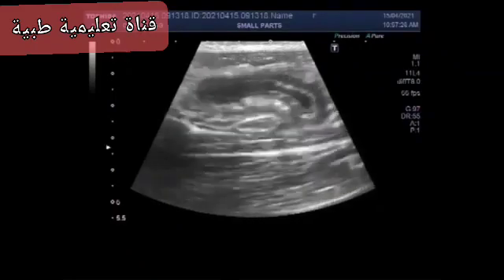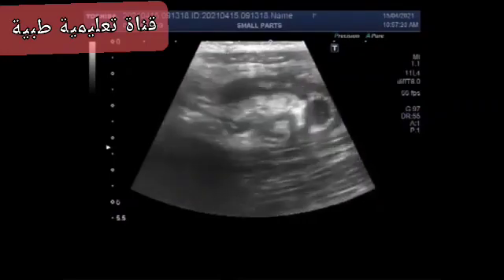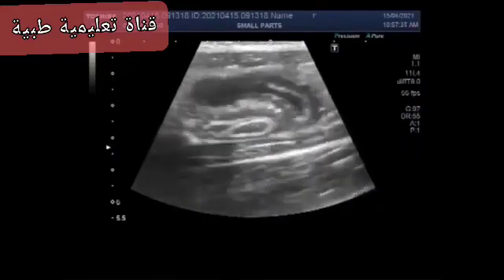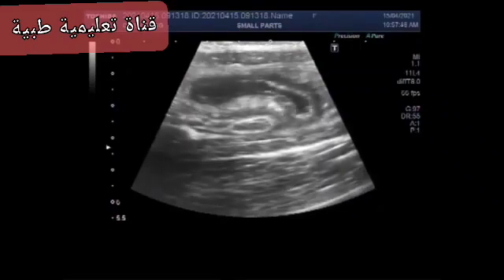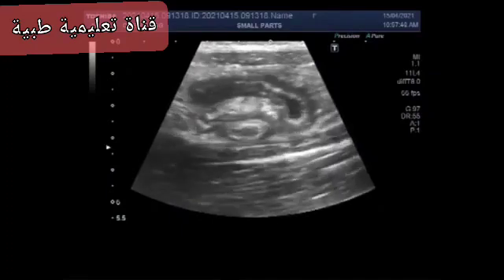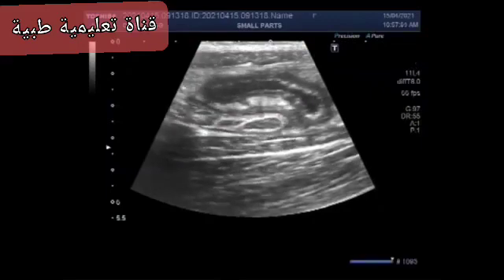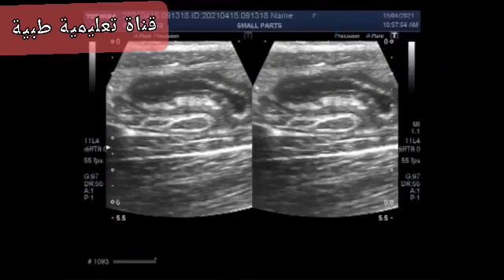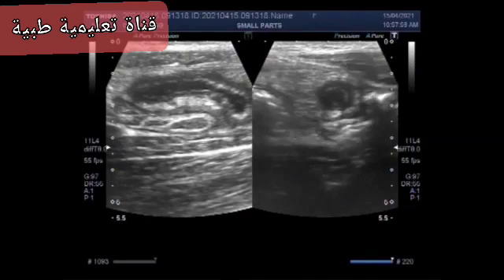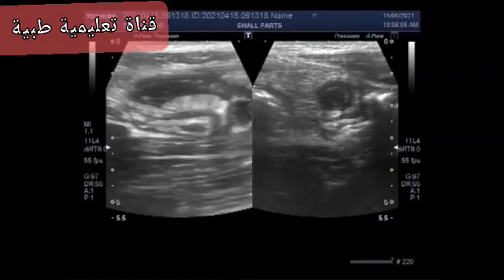Ultrasound can identify the enlarged appendix or an abscess. It is said that during appendicitis, an enlarged inflamed appendix or abscess can be seen in only 50% of patients. But experts in sonography think that the ratio may be higher in expert hands. It is not easy to localize the appendix, but once you practice it, it becomes much easier.